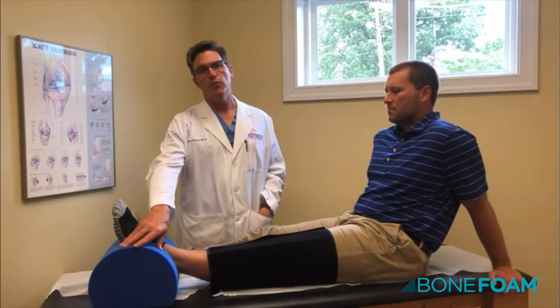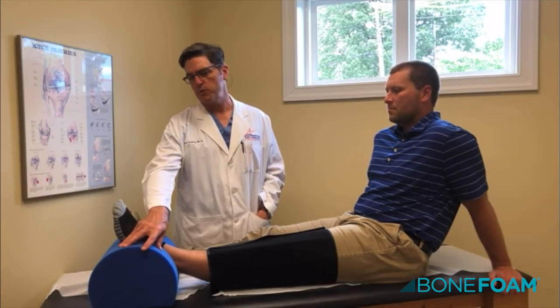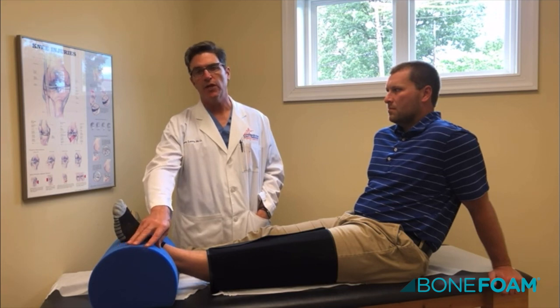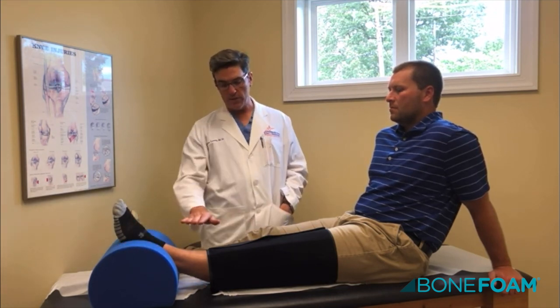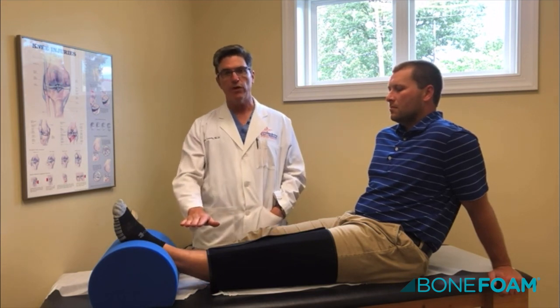This is the BoneFoam, from a company called BoneFoam. The specific name is called the Zero Degree Knee. The reason it's called a Zero Degree Knee is that right now Colby's knee — his leg — is at zero degrees of extension.